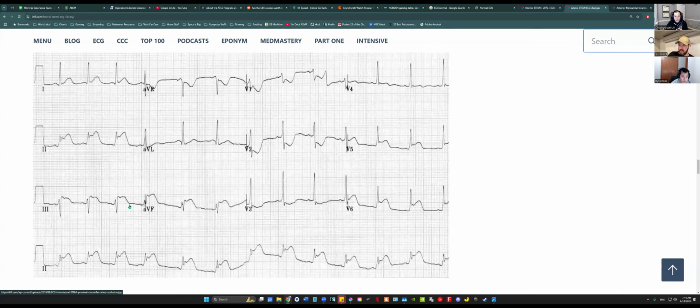How about the inferior leads? Here's the baseline, and that's an elevation. Same thing: baseline, high ST. Baseline, high ST. All right, good. Having done that, just look at it again and see if you can identify the ST elevations and ST depressions. Now that we've collectively pointed it out, I want you to cement this in your head. Looking at it zone by zone, you can identify this one pretty easily now. So: inferior lateral ST elevations and anterior lead depressions.